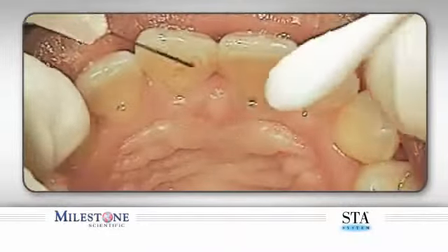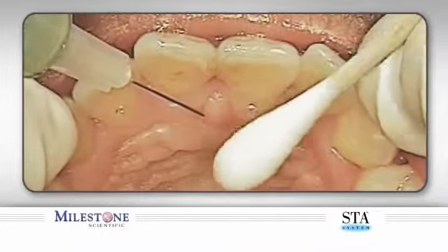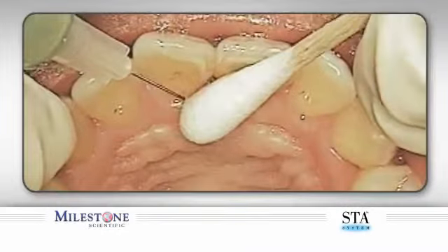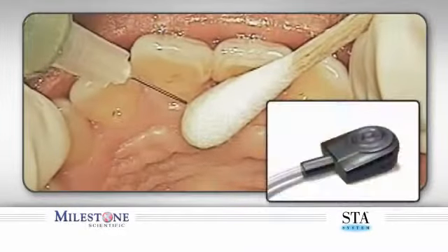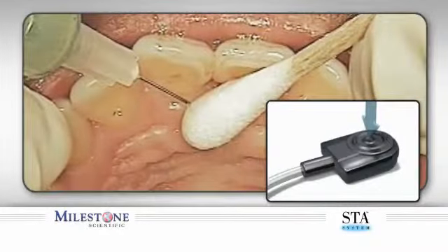We will now show a clinical example of the PASA injection being performed. You can see the needle is applied to the surface of the palate, followed by the placement of a cotton applicator. The flow of anesthetic is begun by initiating the STA cruise control.